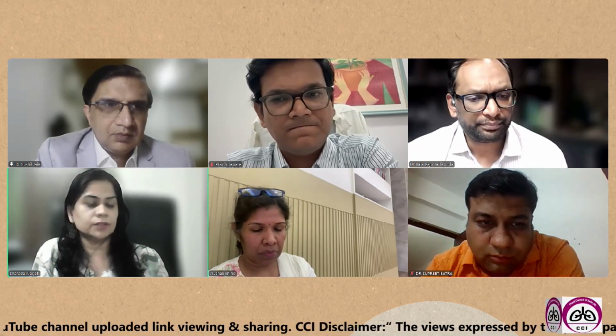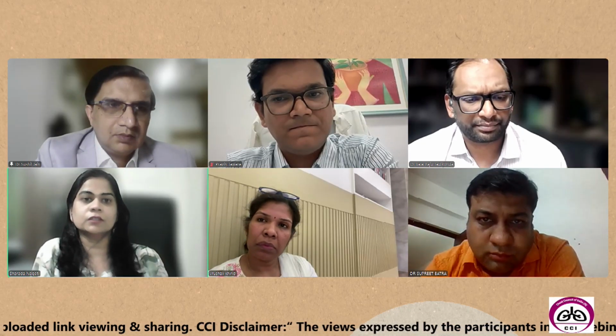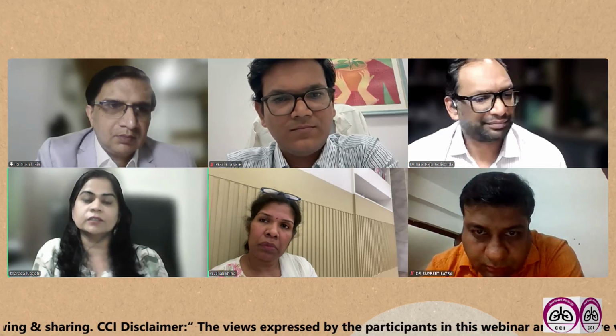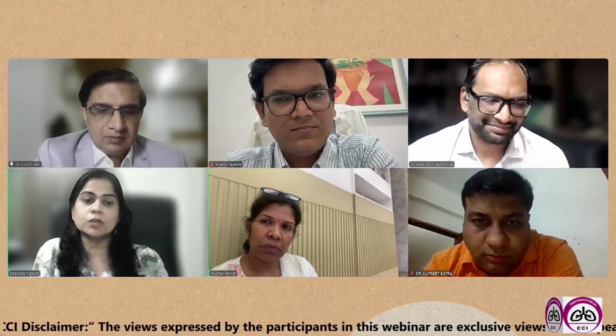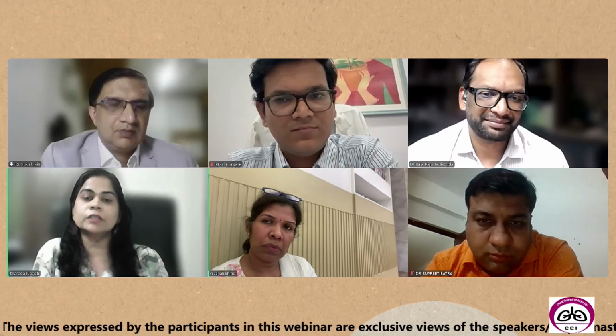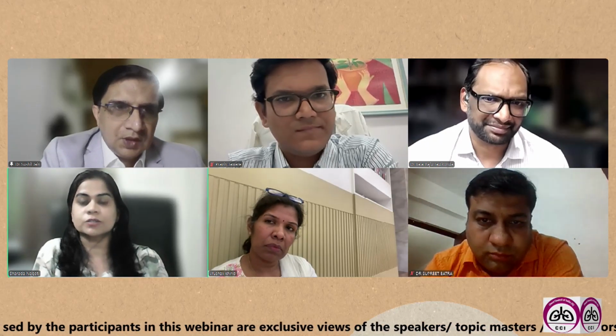The other thing, as Dr. Pravin is saying, I completely agree. Please don't waste any material, even if it is a blood clot, even if it is very small tissue fragments, even if it is excess blood. Please put all the material in the fixative and send it to the lab for cell block preparation.